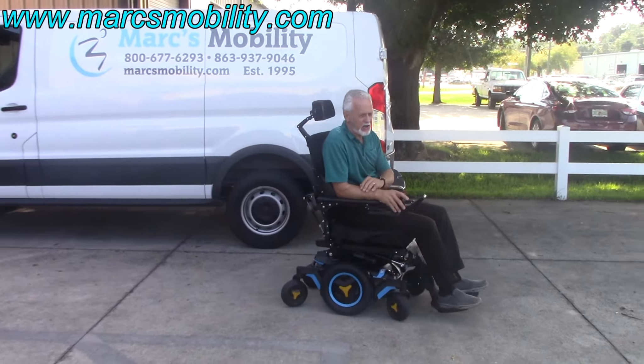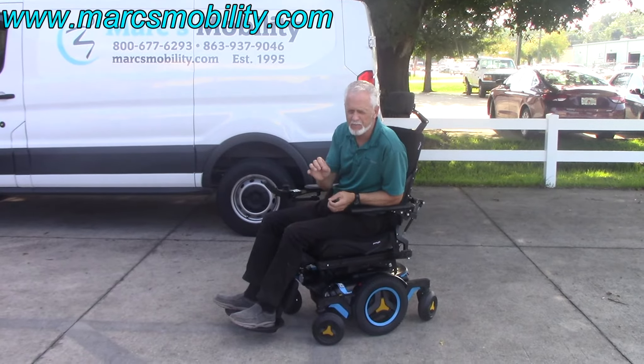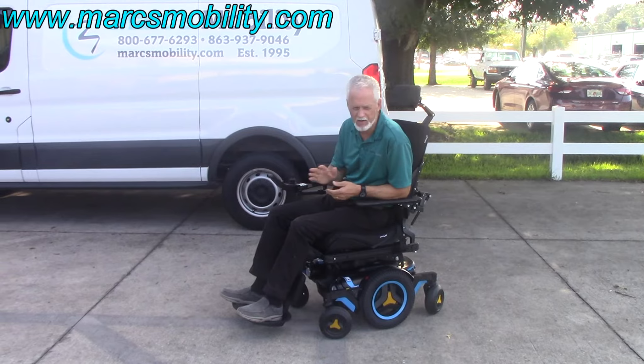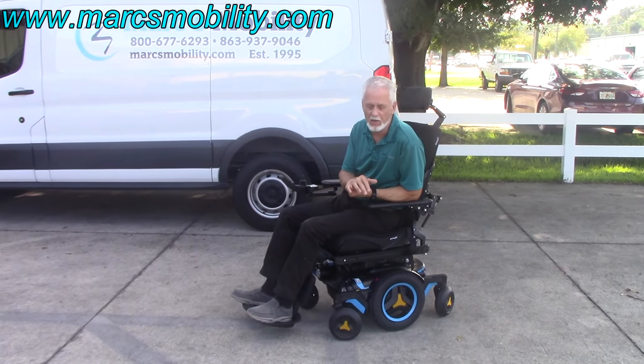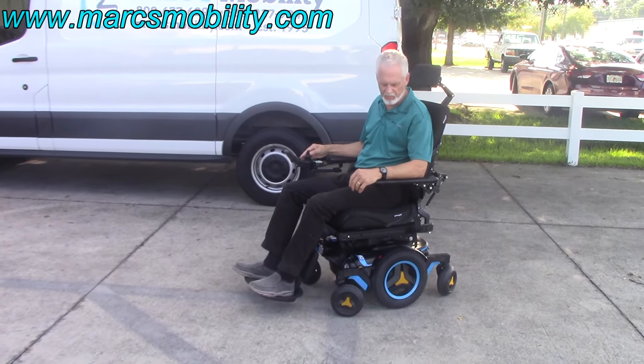This is the M3 power chair, fully loaded with great suspension. The top speed I saw registered was 6.3 to 6.4 miles an hour. This is the top-of-the-line chair — it went to the grass with no problem. Fantastic chair, ready to go.